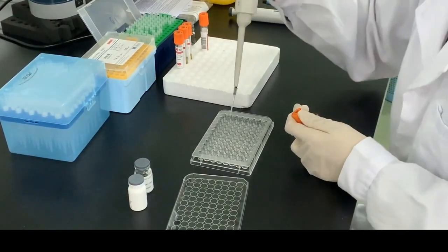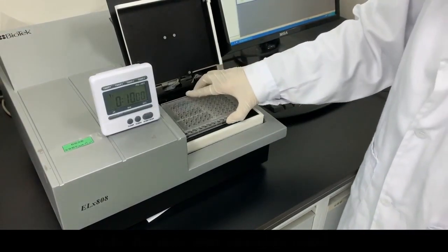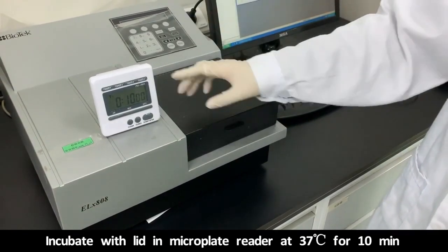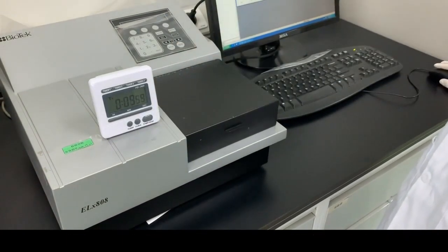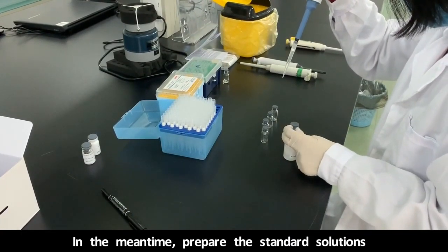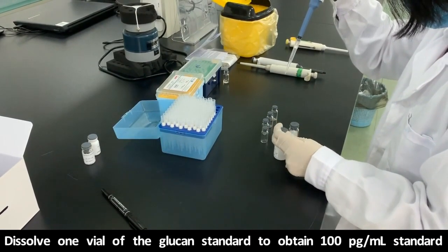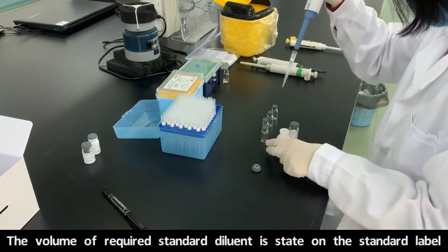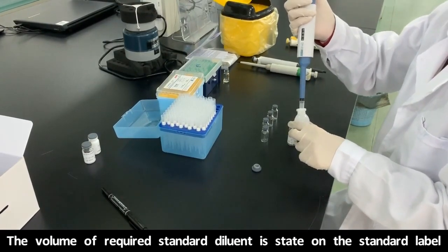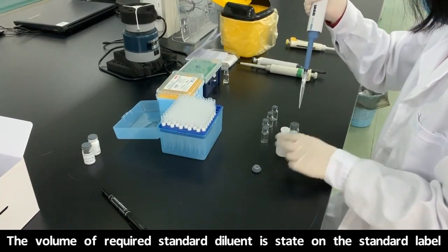The plate with its cover on it should then be placed into the microplate reader at 37 degrees for 10 minutes to warm the plate up. And in the meantime, you then have to prepare the standard solutions. So you dissolve the glucan standard with the diluent, and this is important to get the concentration correct, because this is the primary concentration which is used to prepare all the lower concentrations.